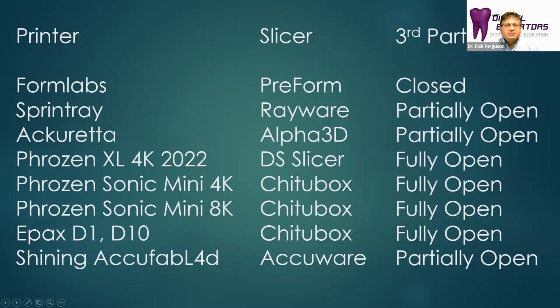Now, the printers themselves, and I have my list of printers here again, ones that we're currently using. The printers themselves will come with their own software for doing the slicing or preparing the models for 3D printing. So the Formlabs has their own.